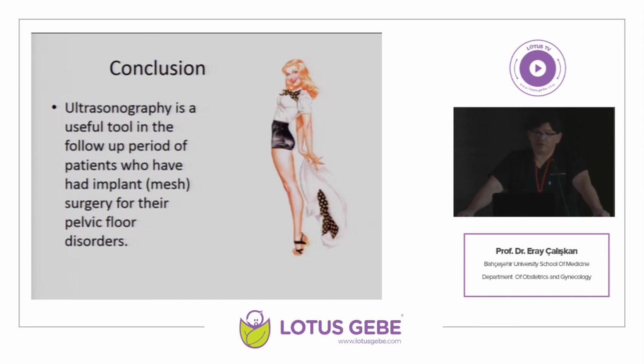So ultrasound is a useful tool. All of us have the opportunity to use an ultrasound in our clinics. So use it and check for complications, and for follow-up. After a time you will notice that you have a better idea of how to place your mesh to improve your technique and to overcome the complications.